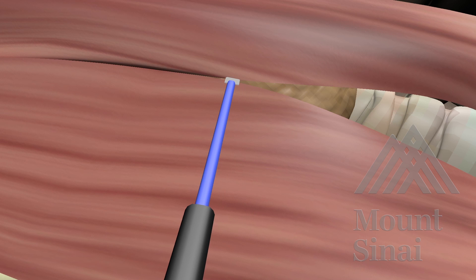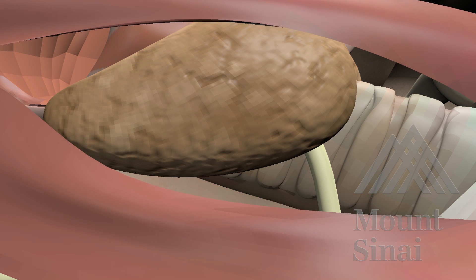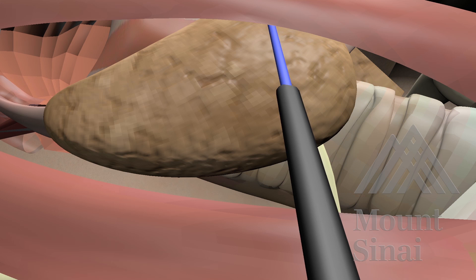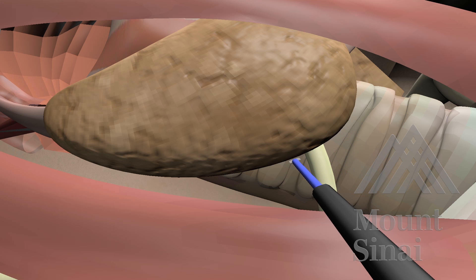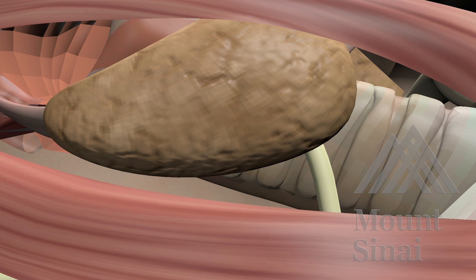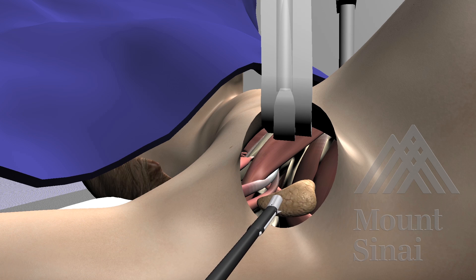This brief animation shows how the sternal and clavicular heads are separated to reveal the thyroid lobe. Then, the thyroid is carefully dissected from the surrounding tissue. Great care is taken to avoid damage to the laryngeal nerves. Once completely dissected, the thyroid lobe is removed.